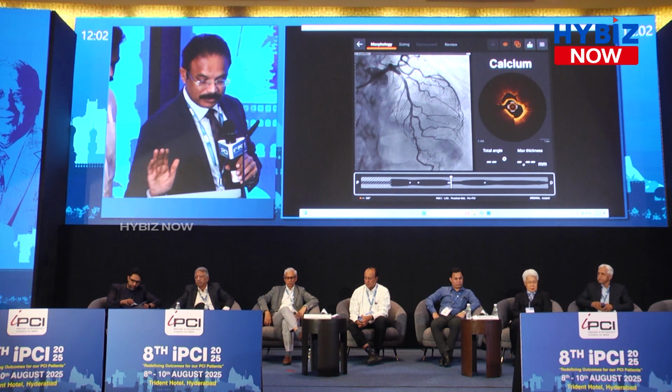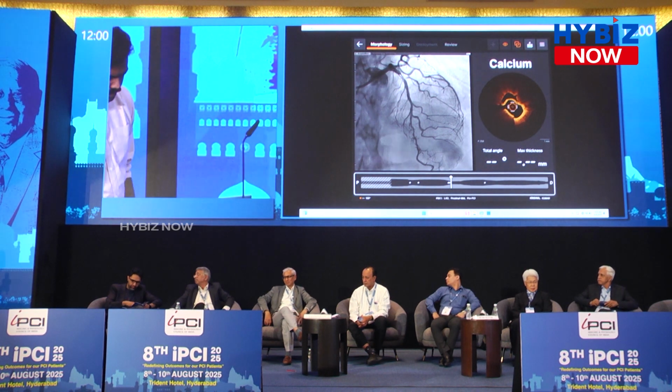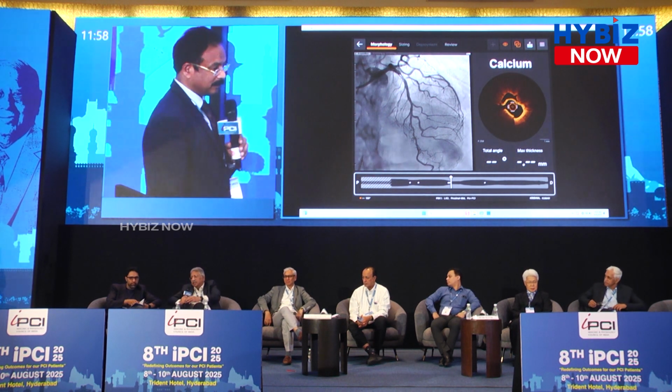Yeah, you can pause. Okay, Dr. Goniko, you can go ahead with the discussion. You can go ahead with the discussion. Here, that's it. I mean, it's right.